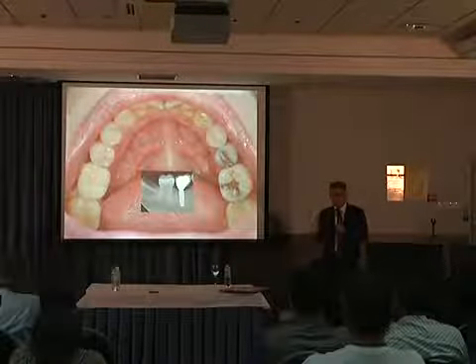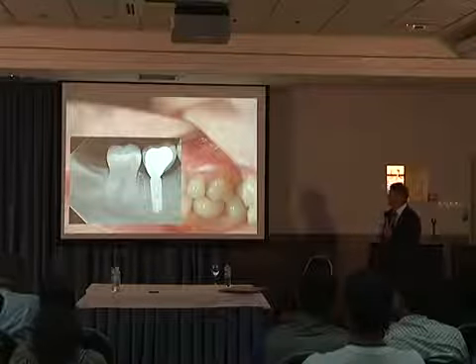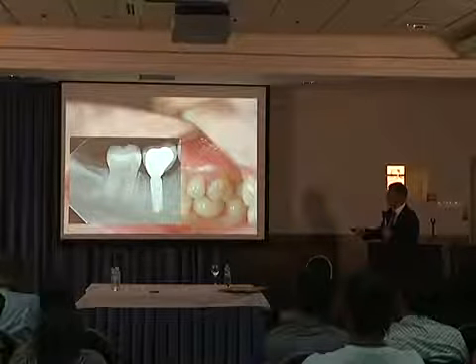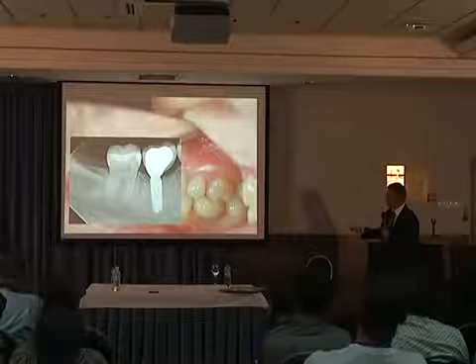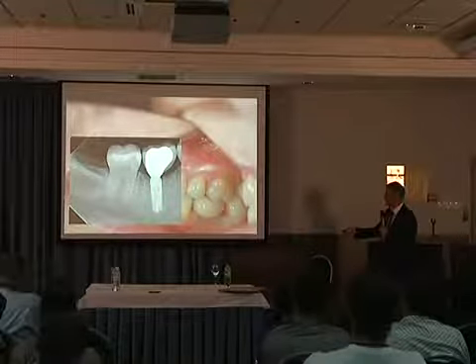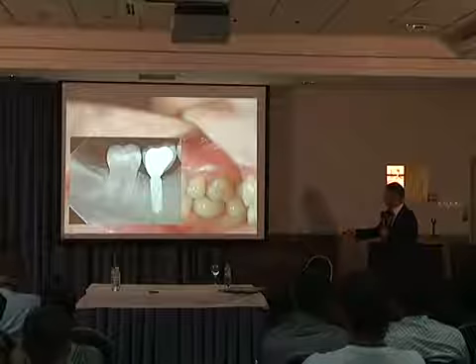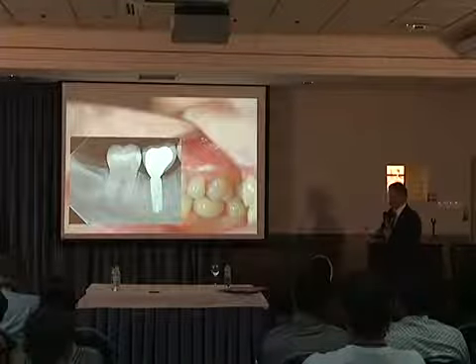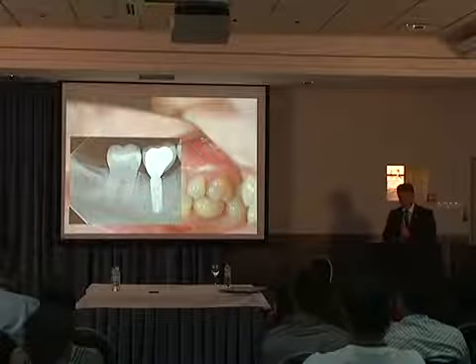Similar like natural intact healthy tooth. Очень похоже на натуральный зуб и достигнут хороший эстетический эффект. 6 months later, bone stability. Через 6 месяцев по-прежнему наблюдаем стабильность костной ткани. Keratinized attached mucosa here. Присоединенная, прикрепленная, кератинизированная мягкая слизистая оболочка. Stable situation, I guess. Стабильная ситуация.